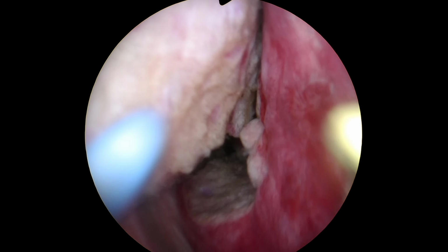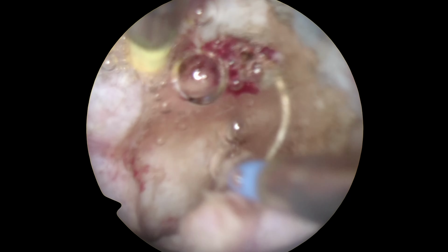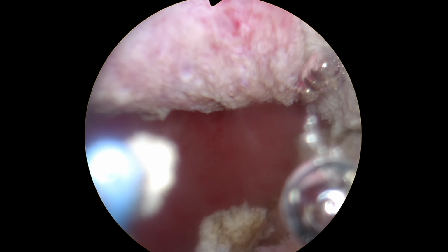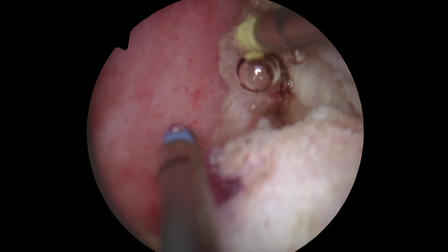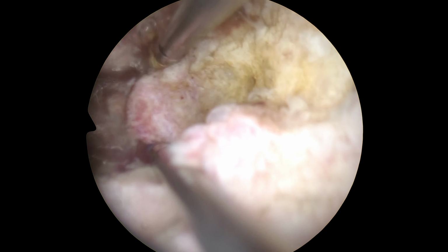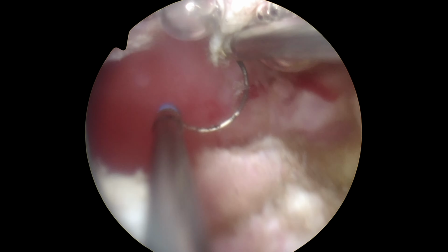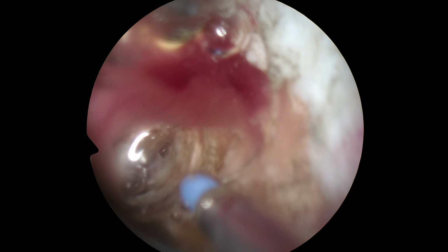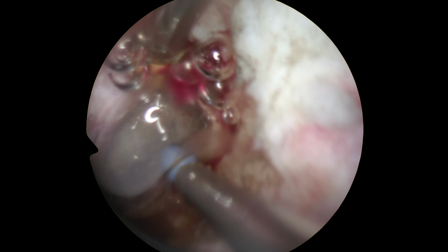So it remains the left half, and for a safer resection, as I said, I will start the resection from left to right, and as soon as the pedicle opens, I will completely cut the myoma off the uterus.